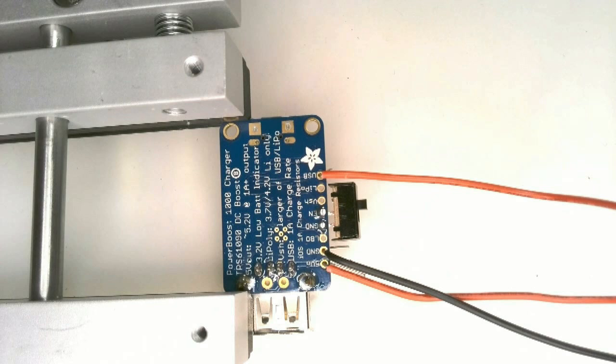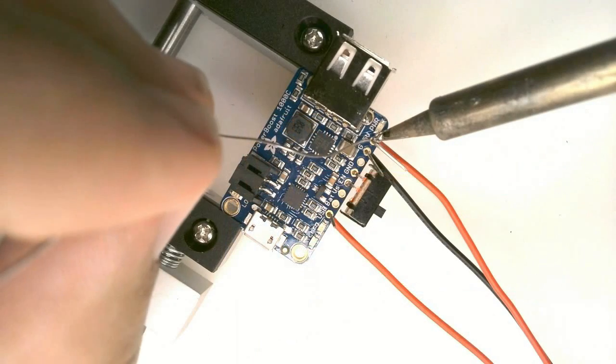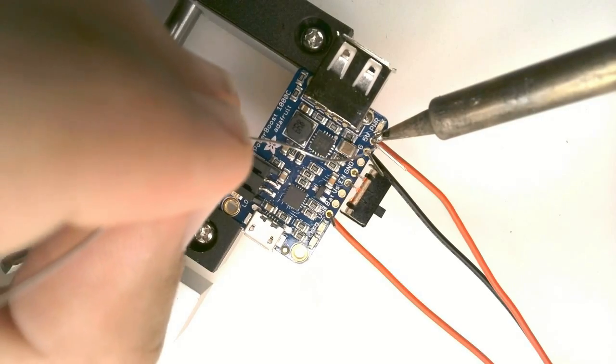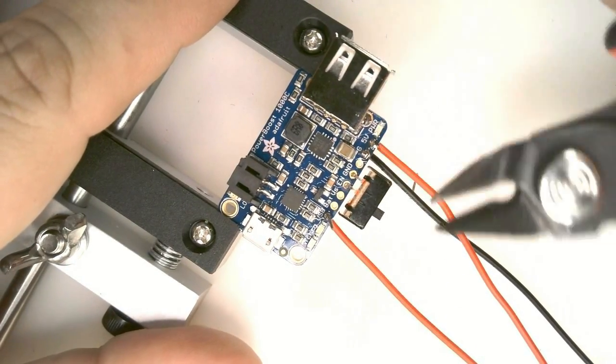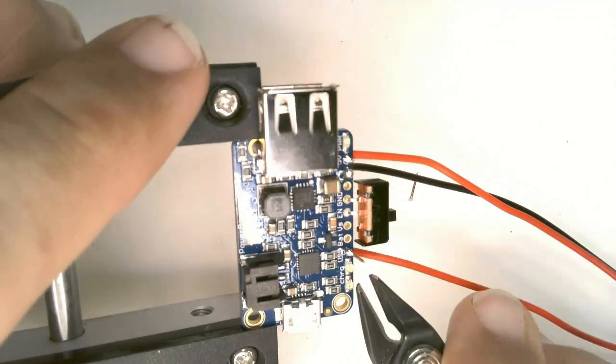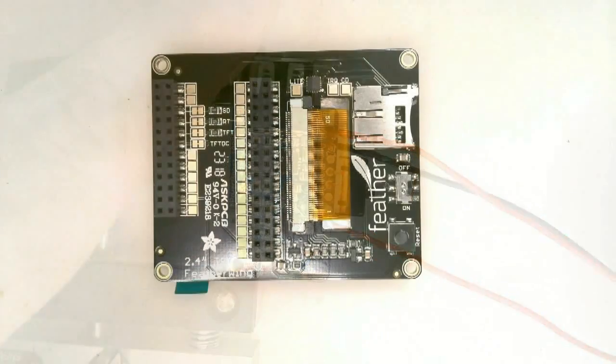The first red wire at the bottom goes to the 5-volt line. The black wire goes to the ground pin adjacent to that. The other red wire at the top goes to the USB pin. Flip the board over and solder the wires from the component side. Clip off the excess leads. That completes the power boost assembly.